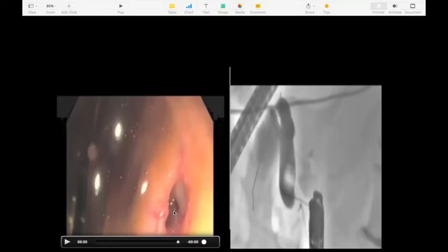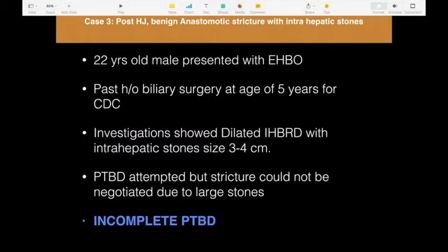If we are doing it with an enteroscope, ideally bring it to either 6 or 7 o'clock, because accessories will come from the opposite direction if the opening is like this. So it will be difficult for accessories to reach.